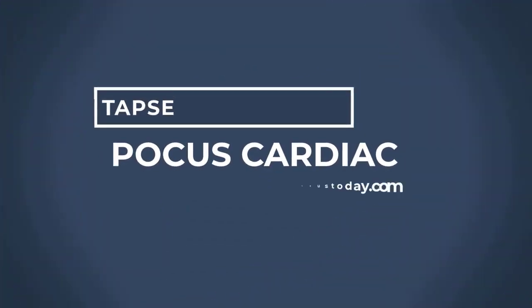Welcome to this tutorial. Today we will look at how to obtain a TAPSE measurement.